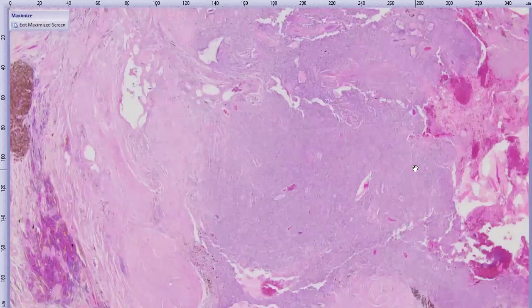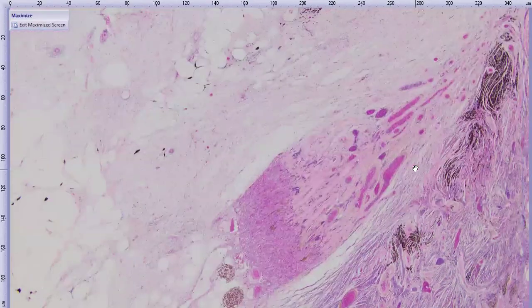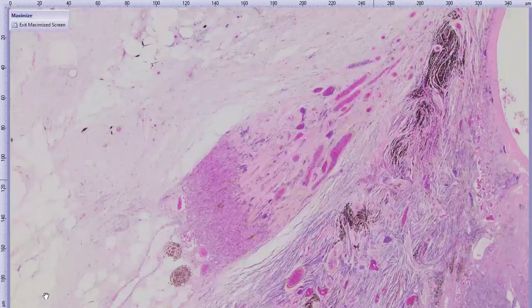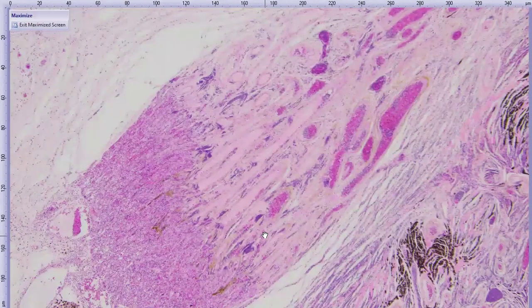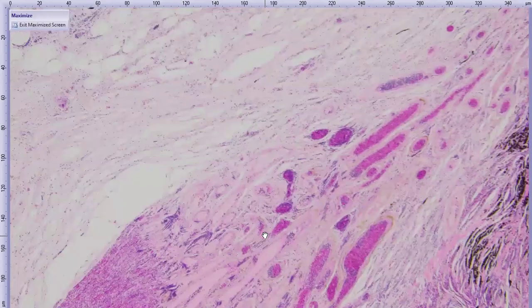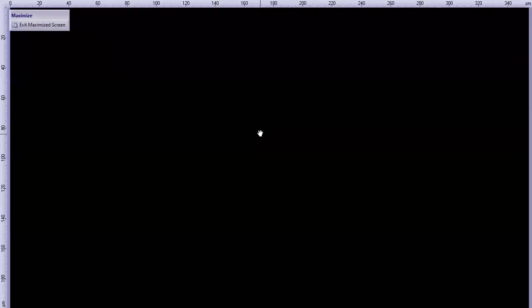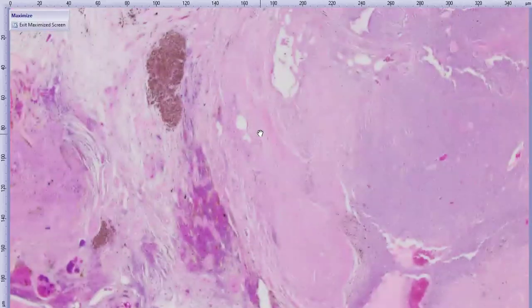Then the last thing that's interesting in this case, well, actually, maybe not the last thing. We can walk briefly into the suprachoroidal space. This structure is really cute. See this structure right here, in the suprachoroidal fat. It's very richly vascular. This is actually normal. It's called the rete mirabile, which I love that name. It sounds like miraculous. The rete mirabile, or choroidal vascular rete, is just a normal structure. But you can also see that this suprachoroidal fat is inflamed, edematous. There are lots of pigmented macrophages about, so that's part of why it was so thickened at gross. And then the last thing that I'm going to show you.